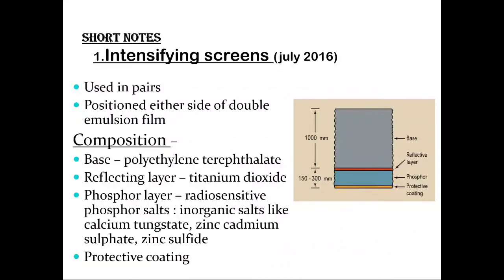And the phosphor layer is composed of gadolinium oxysulfide terbium activated, or yttrium tantalate, and also niobium activated ones, wherein it tries to reflect the green or blue wavelength lights. So these phosphor crystals have the mechanism of fluorescence, which can be increased by addition of small amounts of elements such as niobium, terbium, and thallium.